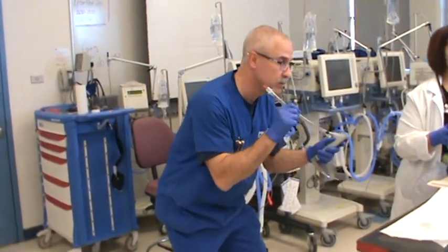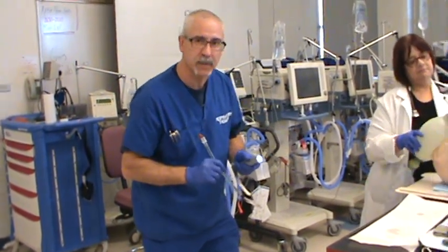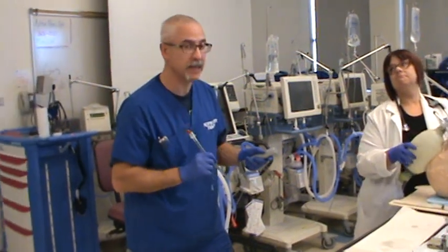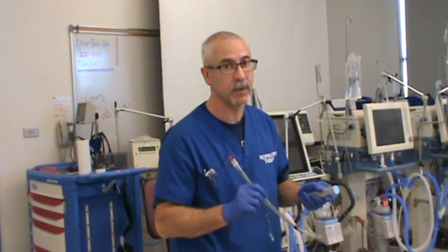It doesn't take a lot of strength to get the tube into a real live patient. These intubation manikins are a little bit more difficult — you should get somebody to hold the head down for you. But in a real situation you probably won't have to do that. You may need somebody to help you with BURP technique: that's Back, Upwards, Right Pressure — that's BURP — or cricoid pressure. BURP is the most common one used.